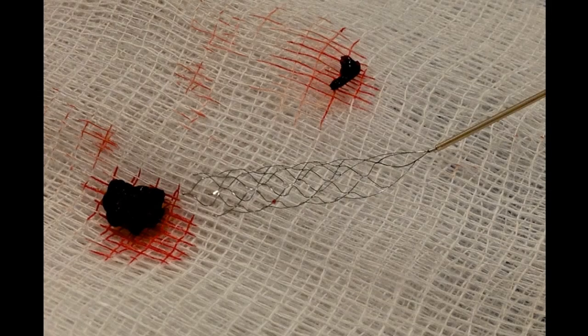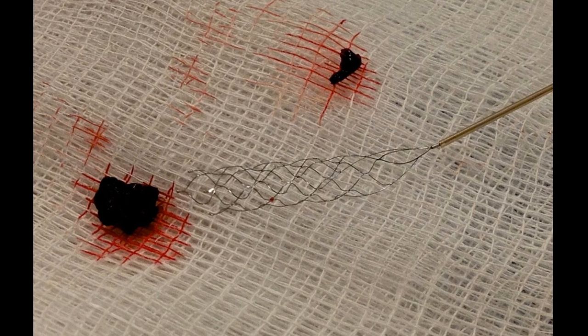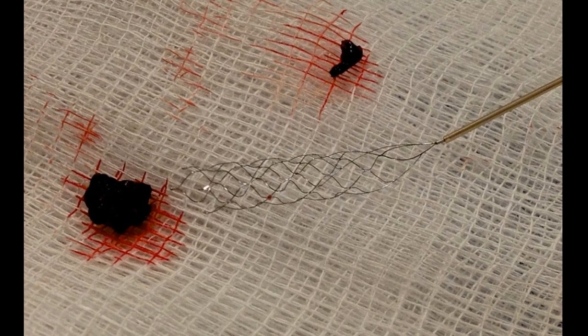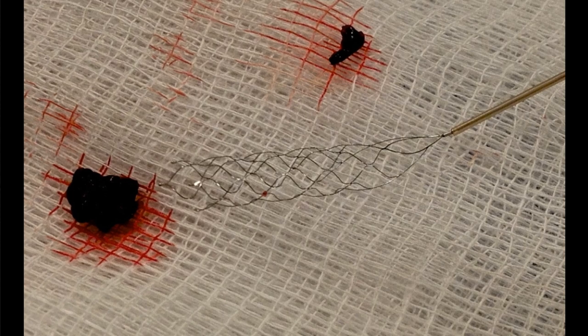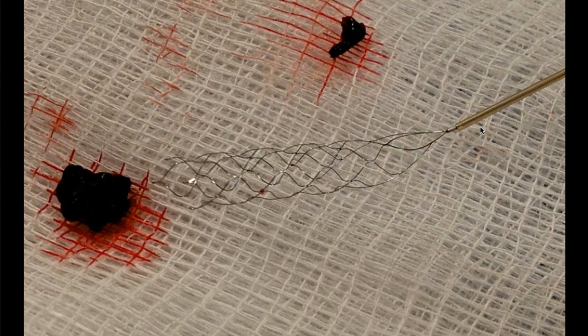So the interventional neuroradiologist deployed the endovascular stroke treatment device, the retrievable stent, and pulled the clot out of the patient's brain artery. Here's what the stent as well as the blood clot look like outside of the patient's body.